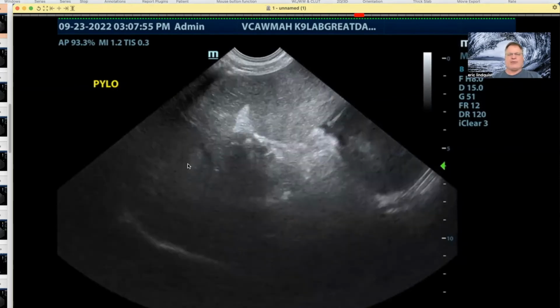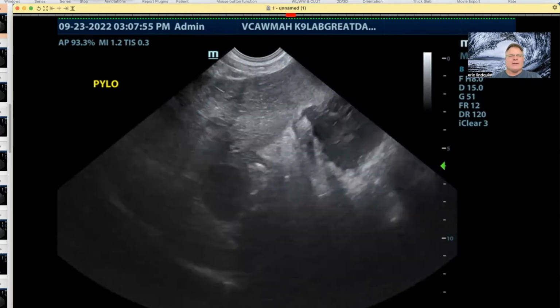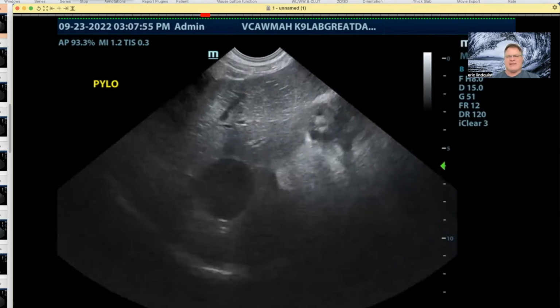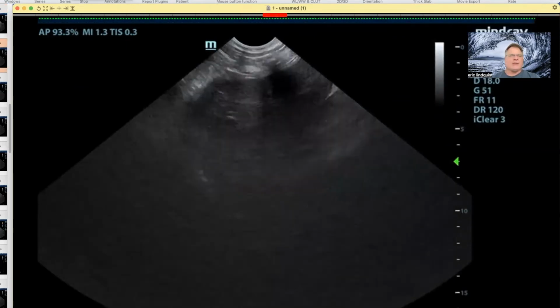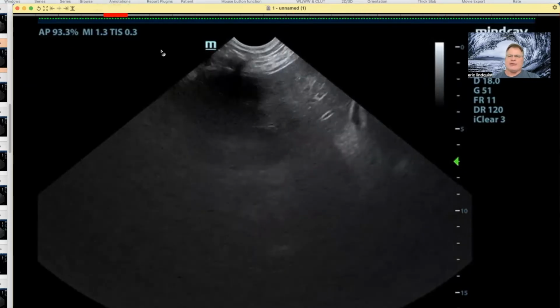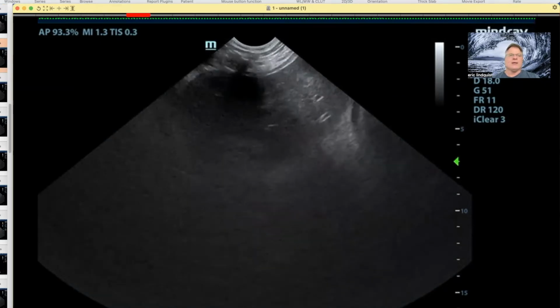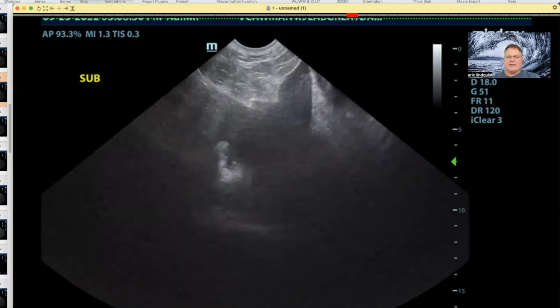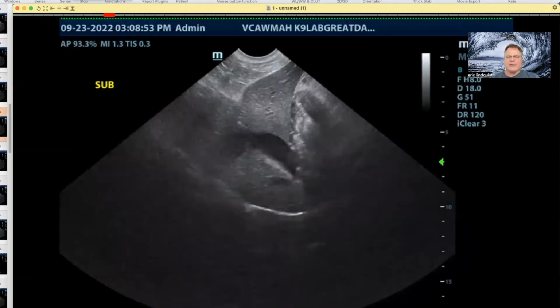Remember, 70% of dogs over 7 will have benign nodules in their liver. So don't call a metastatic lesion unless it is definitively cavitated or disruptive, and not just little hyperechoic nodules like this that are not disrupting anything. You see the curvilinear patterns working through this little blotch. It's like a lipogranuloma or something similar, right? Those are not typically metastatic lesions. Obviously, you want to always inspect the liver and get biopsies when you go in on this type of surgery.